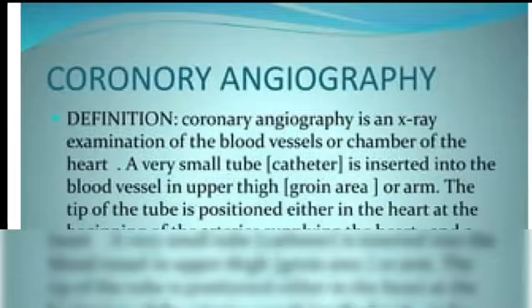Today we are going to discuss the topic coronary angiography. First, what is angiography? Angiography is an X-ray imaging technique in which we image the arteries by injecting a radio-contrast media into the blood vessels to visualize abnormalities. It can be captured as images through a digital fluoroscopy method.